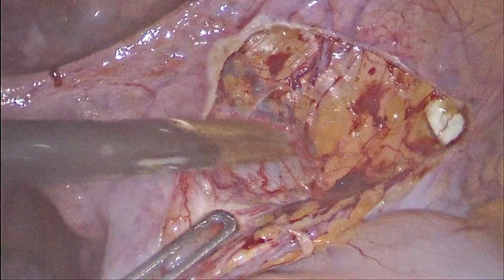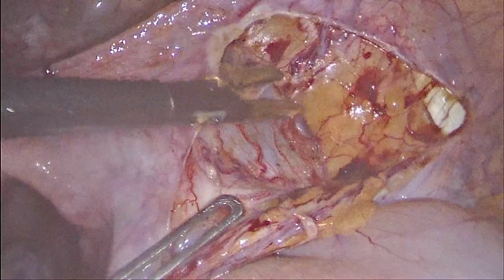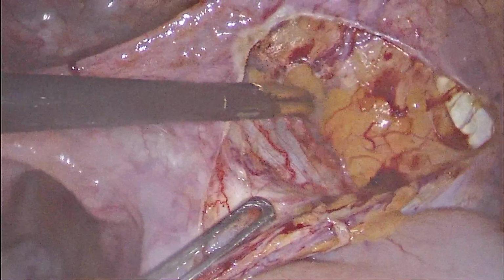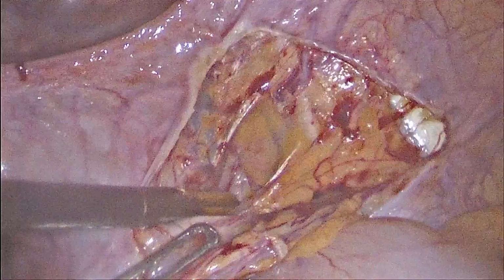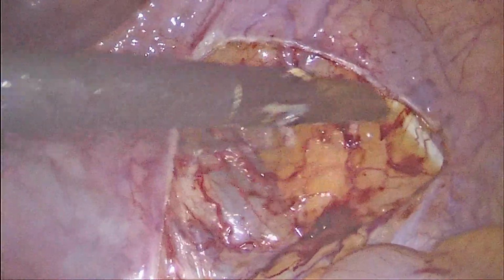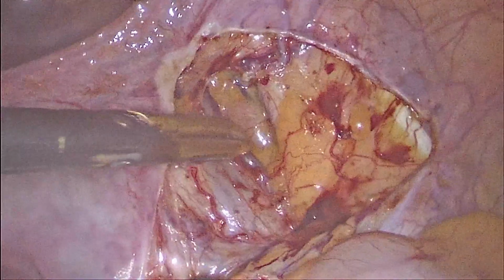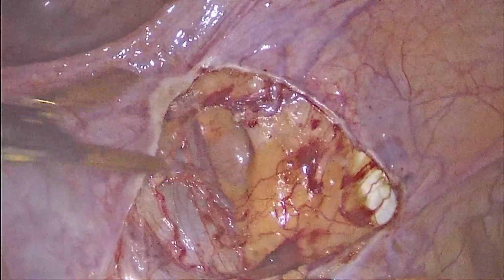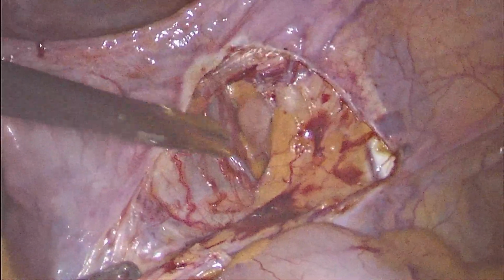It is safer to keep the dissection parallel to larger vessels and keep the surgical field clean so that blood staining does not obliterate the normal plane. So there we can see the ureter, which is identified by peristalsis.